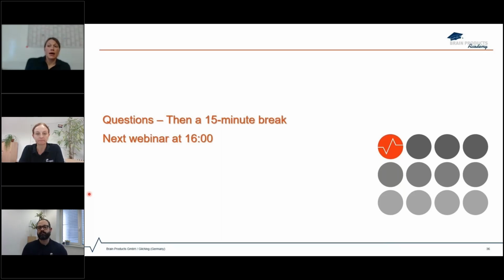And on the fMRI side, I think one of the most important things is to also, as Tracy mentioned in her talk, prior to doing any pre-processing, just scroll through your data and see if there are any visual artifacts that you already see in the data. This could be some kind of streaking or weird ghosting artifacts. And then maybe ask yourself what part of the system could have created that. Is it the introduction of the EEG equipment? Is it due to some other factor or some other equipment in the scanner? Do you see it across all your subjects or just one?